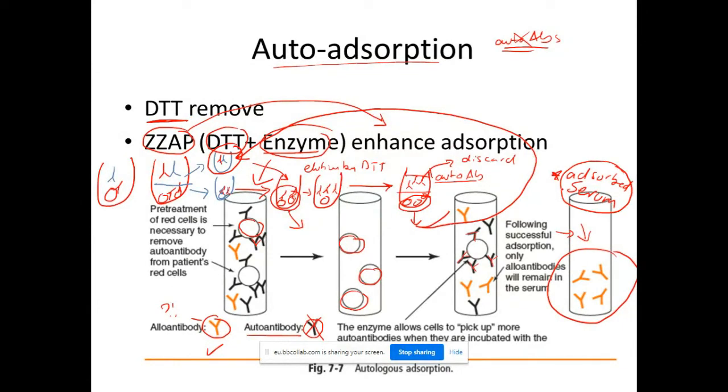بنسمي الان هذا adsorbed serum. اوكي، اذا adsorbed serum نحصل عليه بعد شغل صح، لكنها however help us. طب الحين ما عاد عندي auto antibody. الآن I can do antibody identification test. لكن الحين الانتيبودي identification test راح نشتغل عليه السامبل عندي بيكون اسمها adsorbed serum، يعني مو سيرام عادي. إذا قلنا adsorbed serum نعرف أن الadsorbed serum هذا مر بعدة مراحل لما وصلنا له. Clear?